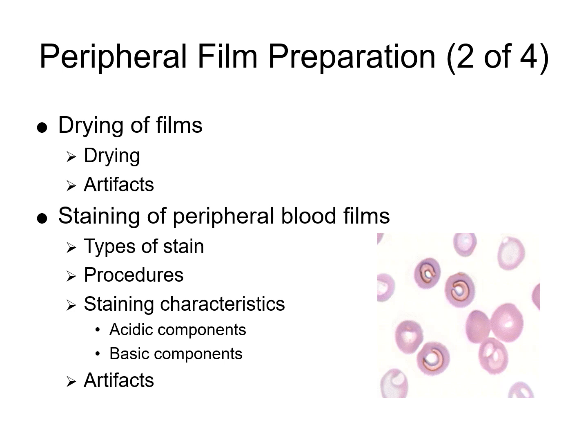Staining enhances the visualization of cellular components, and it is vital for accurate morphological assessment. The most commonly used stain is the Wright Giemsa stain. This is a polychromatic stain that provides excellent differentiation of cellular structures. The staining procedure generally involves fixing the dried smear with methanol, followed by application of the stain solution for a specific time, rinsing with a buffer or water, and then drying again.